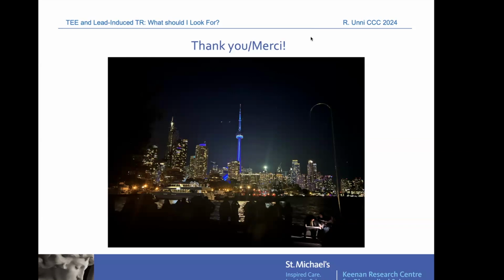So I think TEE is actually a great tool now that we have X-plane or multiplane as well as 3D. It allows us to understand this a lot more than what we could do 6, 7, or even 8 years ago, as short as that. So I think there are lots more options. So yes, despite the widespread denial of lead-related tricuspid regurgitation, please send them along, and we'll be happy to explore that for you or with you.